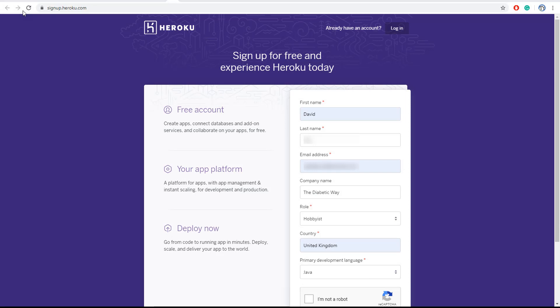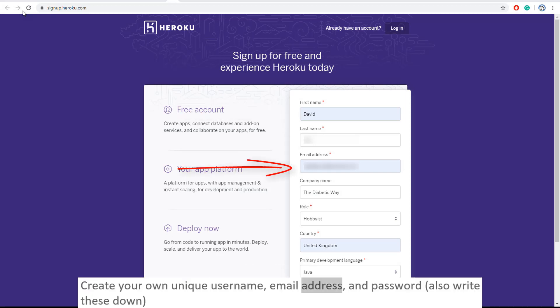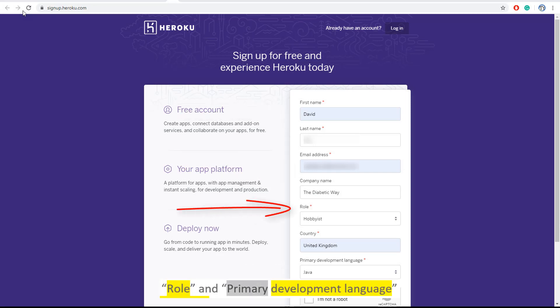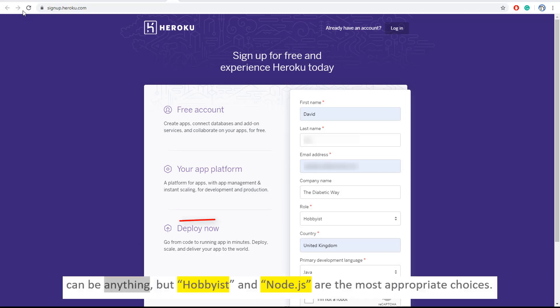Now enter your account details: first name, last name, email address, role and primary development language. Can be anything, but hobbyist and node.js are the most appropriate choices.